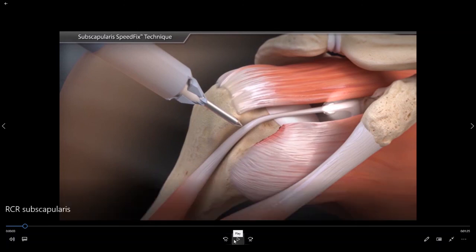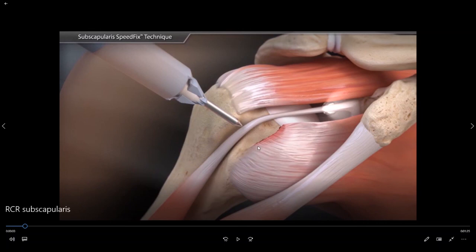So here we have made access to the shoulder via a cannula or a portal. We have identified that there is a tear of the upper border of the insertion of the subscapularis tendon. Immediately adjacent to that area is the long head of the biceps tendon. In the office we probably discussed that when you have a tear of the subscapularis tendon it can cause this tendon to come out of place and maltrack.